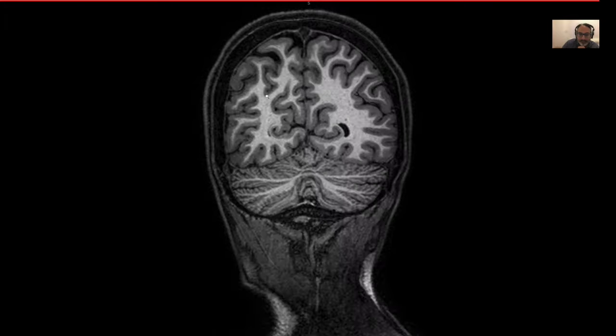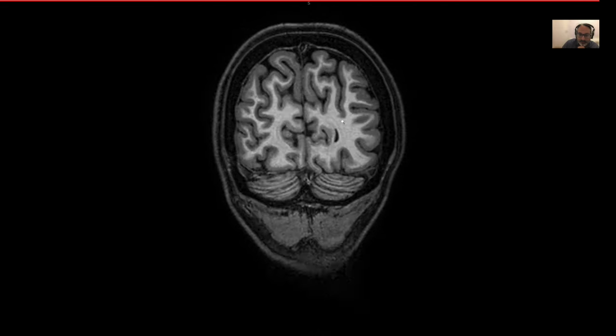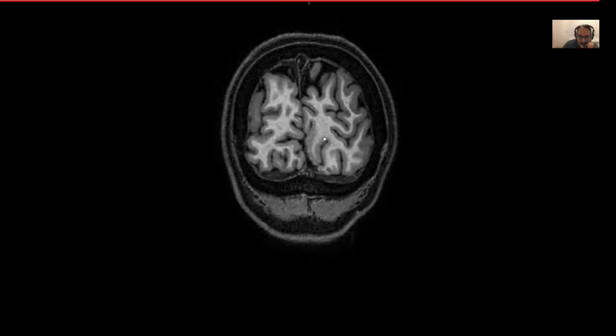And here, I keep moving posteriorly. Here you can see the cerebellum. Now we're towards the occipital areas. That's the cerebellum again. That's the superior sagittal sinus. And that's the posterior aspect of your skull.